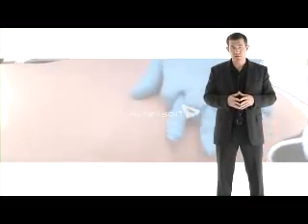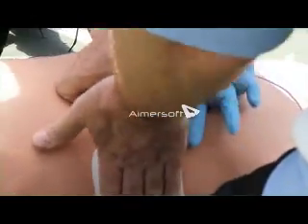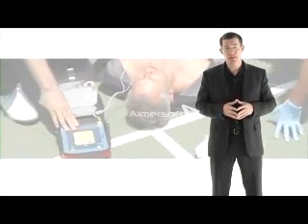Peel the first pad from the backing and stick to the victim's skin. Peel the second and stick to the victim's skin as well. Press the pads firmly to the skin if prompted. Stop CPR so the AED can analyze the rhythm and determine if a shock is needed.